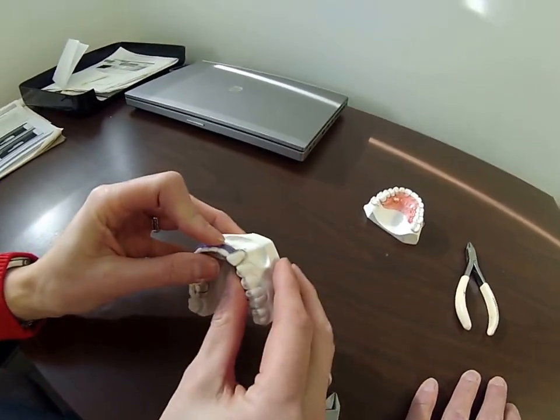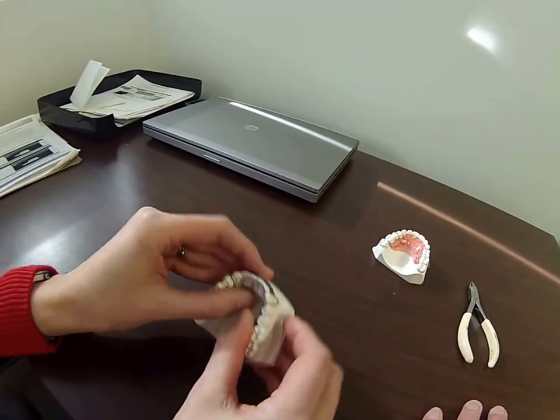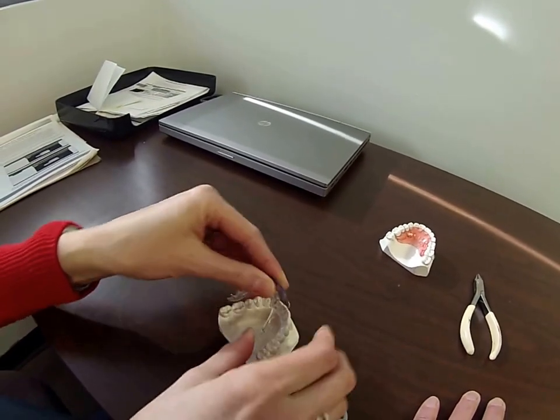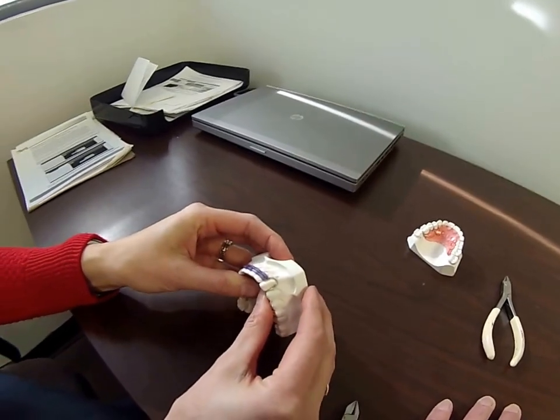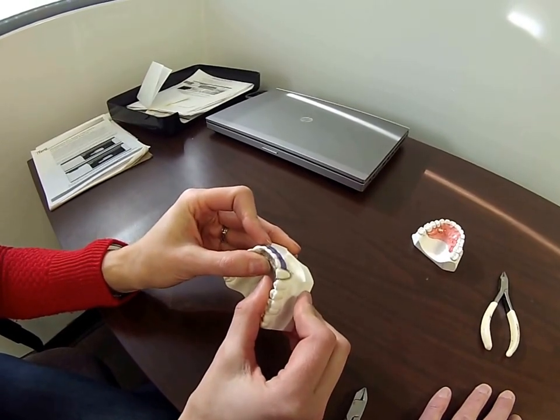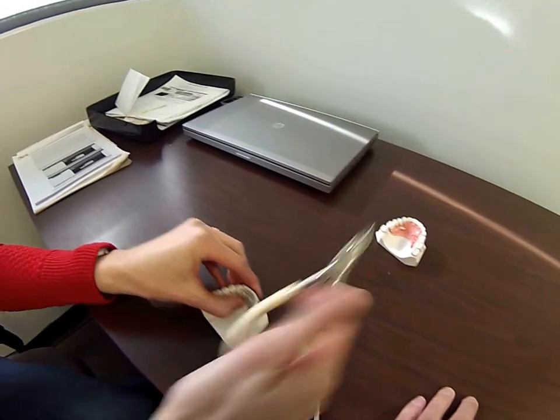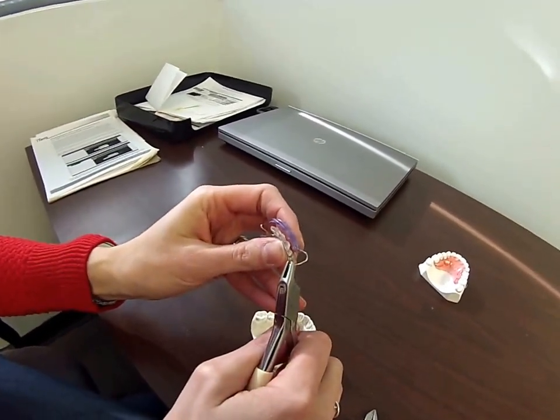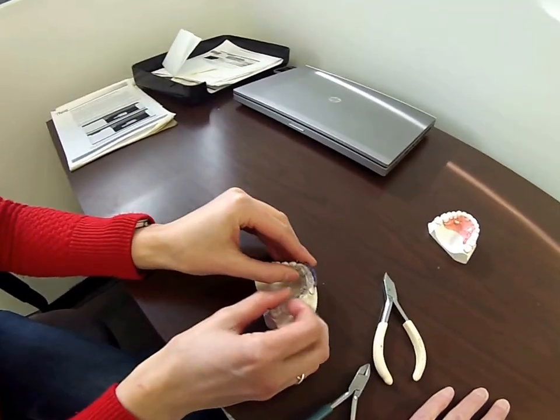Put it back in the patient's mouth. The loop should be contoured closely and tightly up against the canine. If you need to do follow-up bends, go ahead and do some more. You do not want to do this with a plier. Megan's going to demonstrate where you could do it with a three-pronged plier on top, but I do not want you to do that — do not do this bend. Use your fingers.